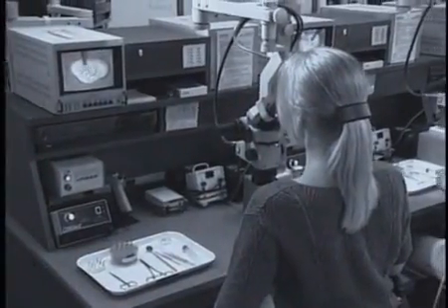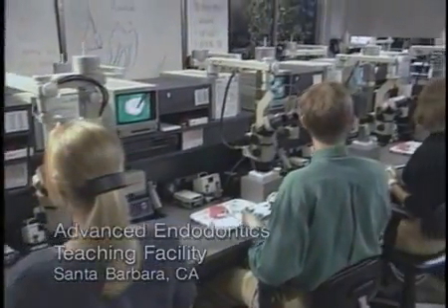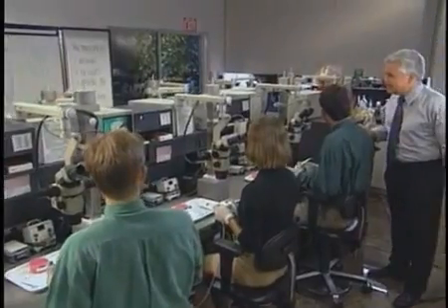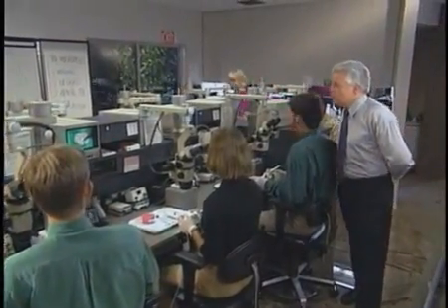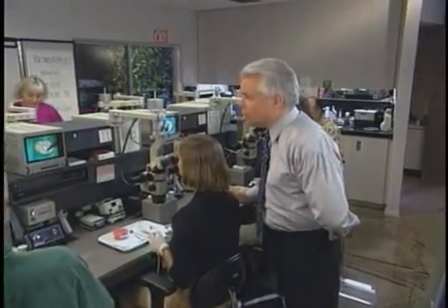Today we're going to start off with each one of you preparing an access cavity for a root canal procedure. Now I don't want you to do anything different from your normal access technique. Just do what you would do in your everyday practice. So I'll give you a few minutes and then I'll look at what you've got.